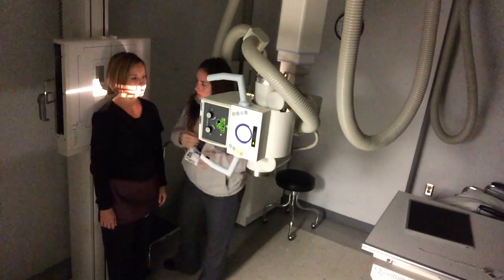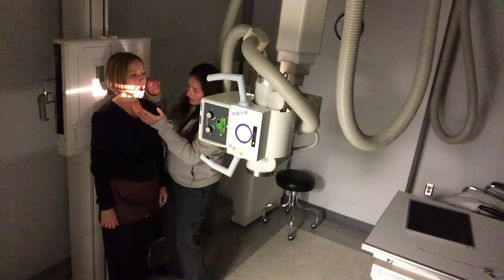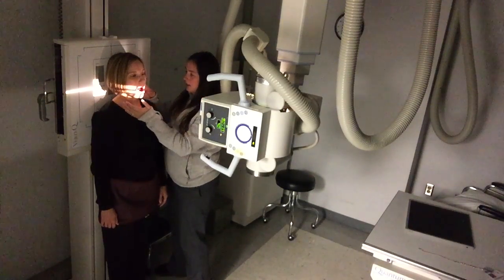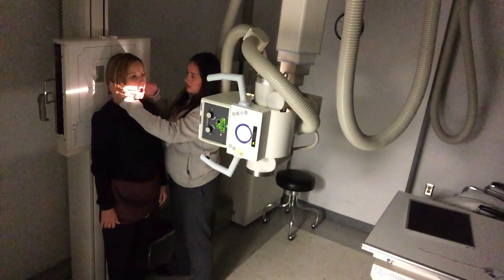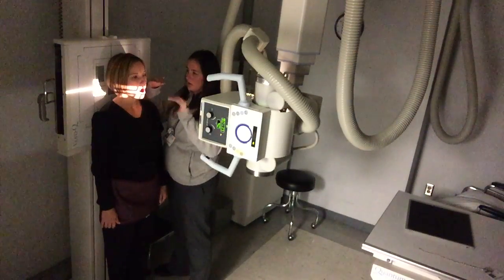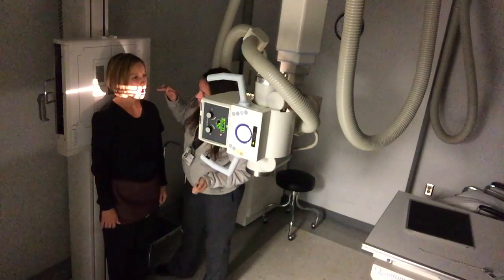For this projection, we are going to have their mouth open. I usually just have them open their mouth comfortably at first so they're not stressing their jaw throughout the entire exam. You're going to look at the lower line of their molars, teeth, and incisors. Then I'm going to find the mastoid process — it's right behind the ear, a bony projection there. I'll look for her incisor and raise or lower her head to make sure those are parallel with the floor and in a horizontal orientation together.